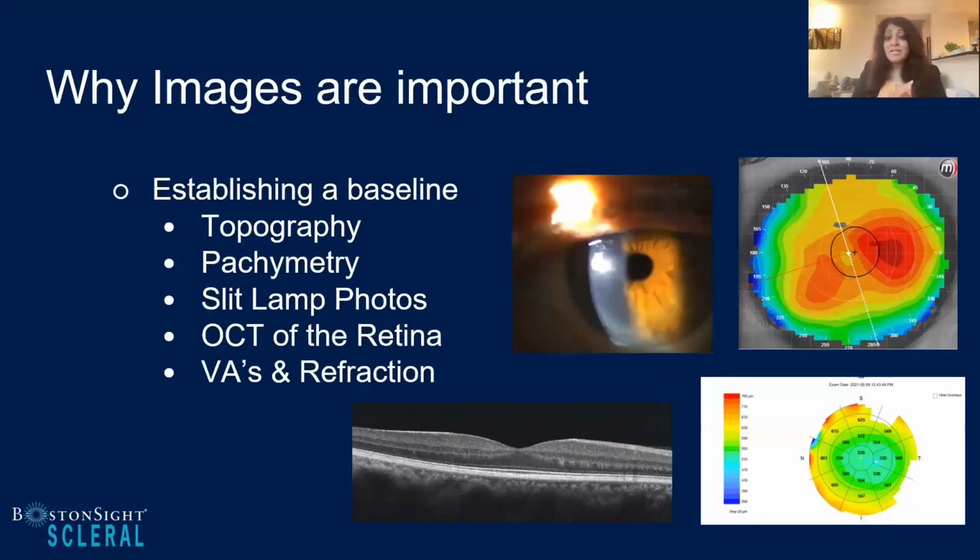Some of the key baseline images that I take with all of my scleral lens patients is, for sure, I'm going to get a baseline topography. I'm going to do pachymetry. And I'm fortunate that I have an OCT and I have this incredible function where I can take corneal pachymetry. So it gives me an image of all of the pachymetry readings all over the cornea, which is so useful, because the key of me taking any of these is to make sure that I'm not doing any harm, and I have a good way of tracking to make sure that I'm not doing anything with these corneas and not causing any problems with the sclerals that I'm putting on them.